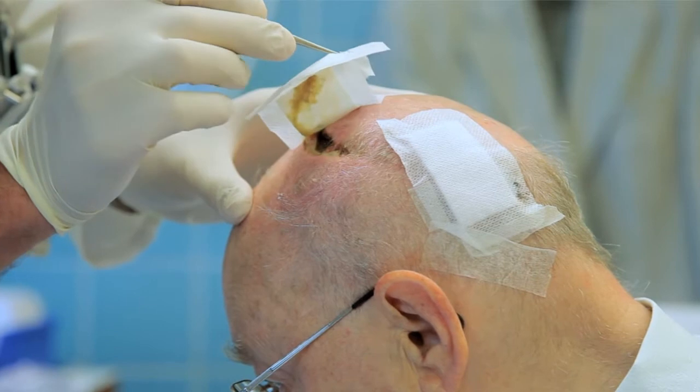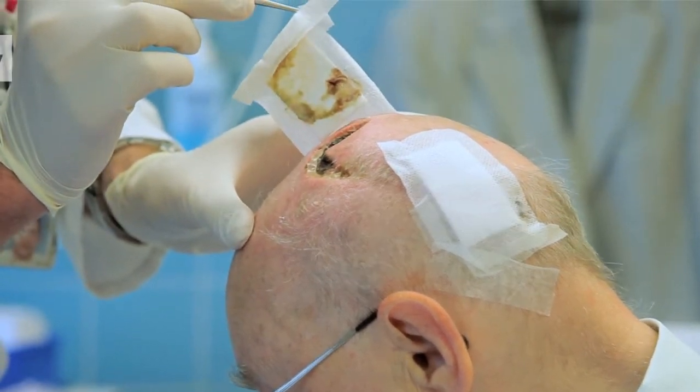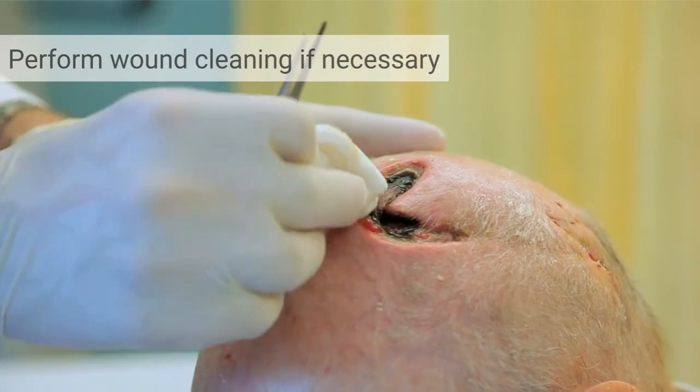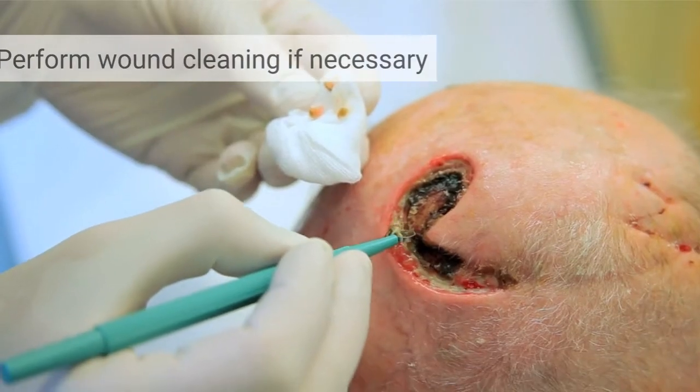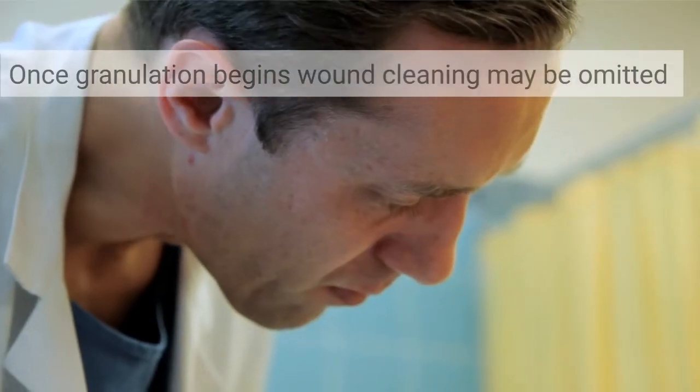The application of One is very simple. After removing the old dressing, perform a basic wound cleaning if necessary. Once granulation begins, wound cleaning may be omitted.